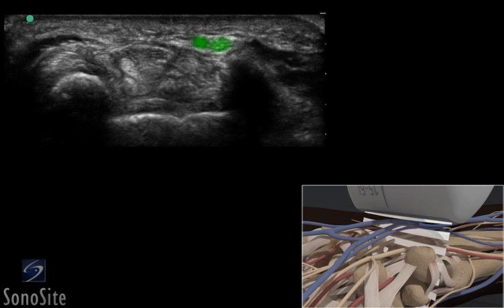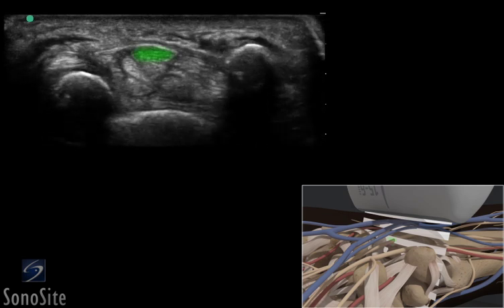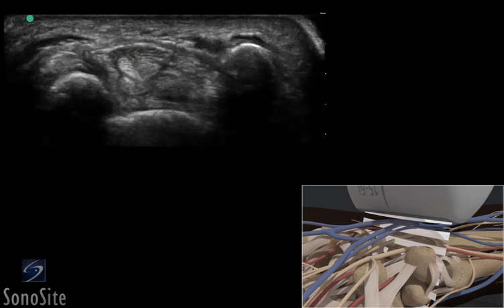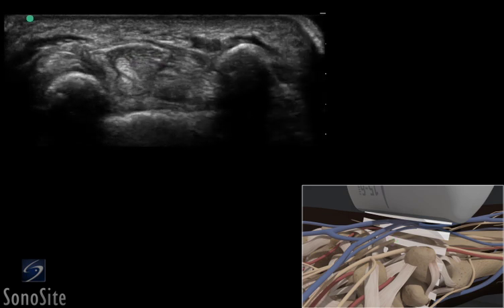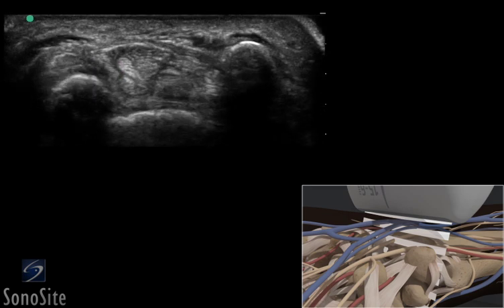The ulnar artery and nerve can be seen in Guyon's canal, superficially, and on the medial surface of the wrist. The median nerve is a dark, hypoechoic, elliptical-shaped, honeycombed, fascicular structure just ulnar to the flexor carpi radialis tendon, in line with the three carpal bones.